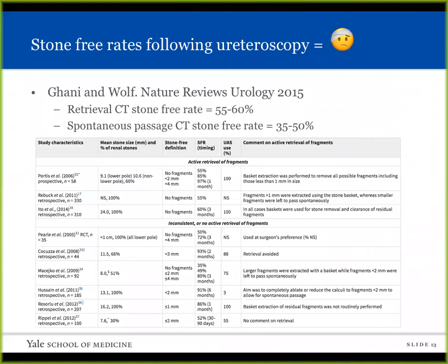And when they looked at stone free rates defined as no fragments, they found that the CT stone free rate when there was active retrieval of fragments ranged between 55 to 60%, and when there was no active retrieval or spontaneous passage, the CT stone free rate ranged from 35 to 50%.